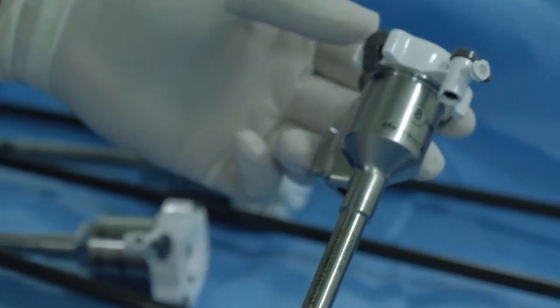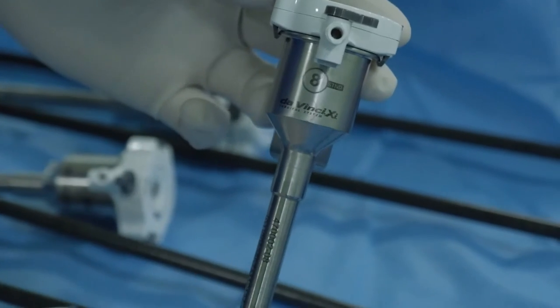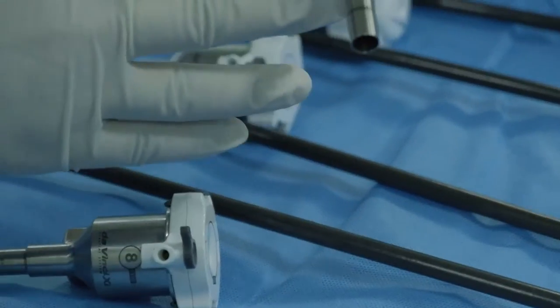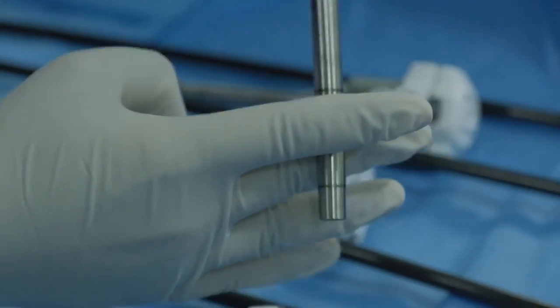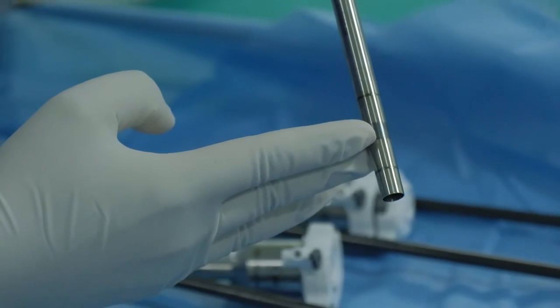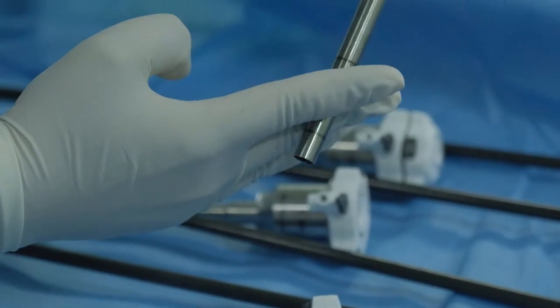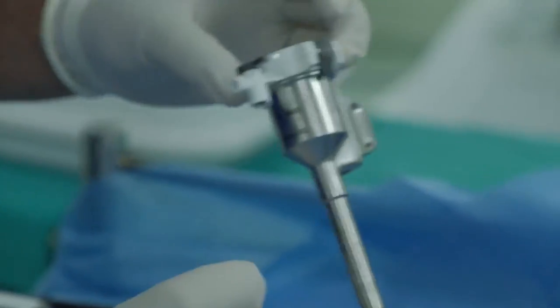These are the 8 millimeter cannulas which are used for placing the ports. These are the ports which are placed. This is a remote center. So this remote center is a thick black line which is not going to move in space. So this point is fixed. We want to keep this point at the level of the fascia, and because it is fixed, there is no trauma to the fascia, there is no trauma to the abdominal wall.